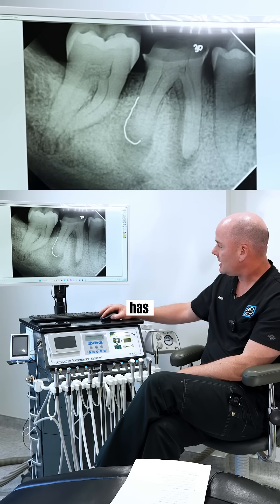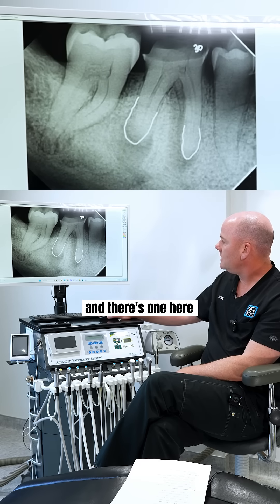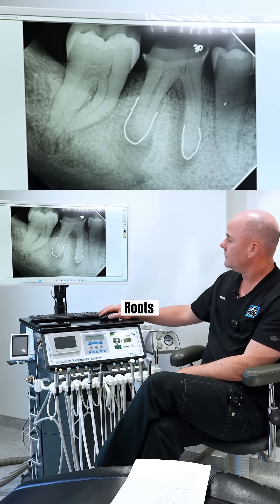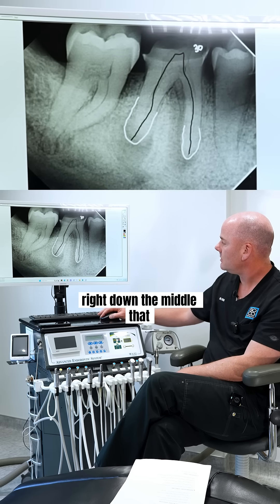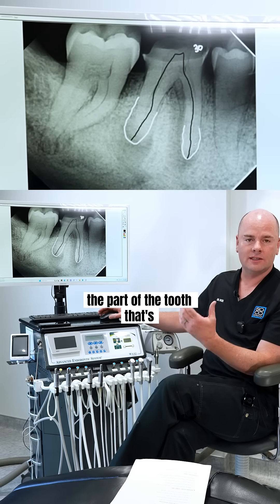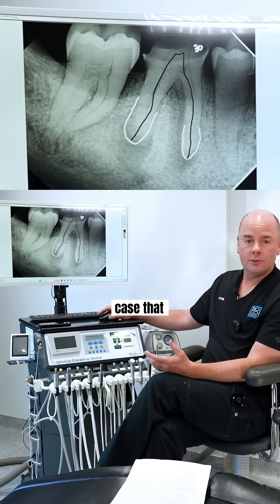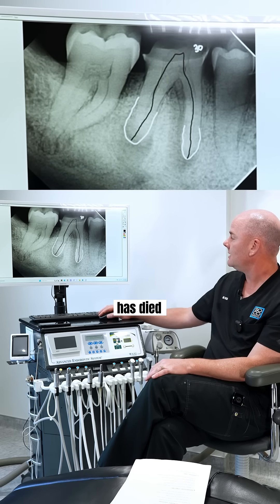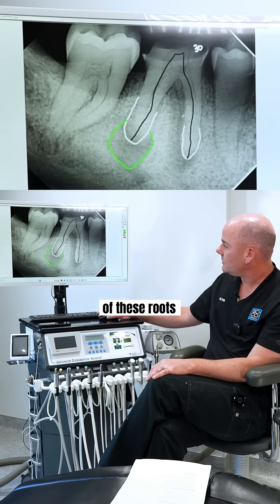This tooth has two roots — there's one here and there's one here. Inside all of our roots there's a hollow canal that runs right down the middle. That hollow canal contains the part of the tooth that's alive — it's called the pulp. In this tooth's case, that pulp has died, and you can see these dark areas around the tips of these roots.